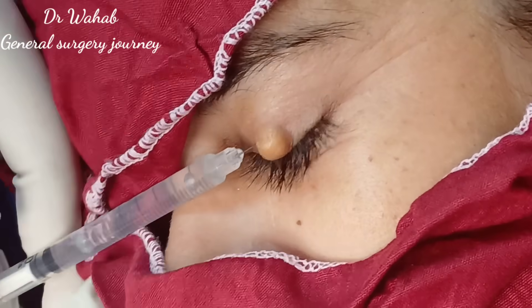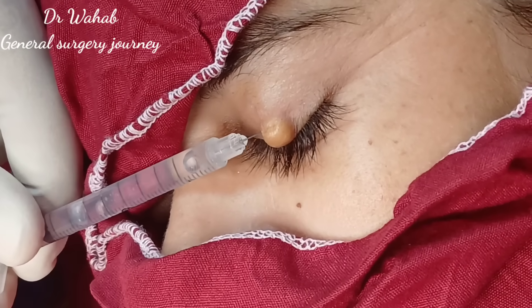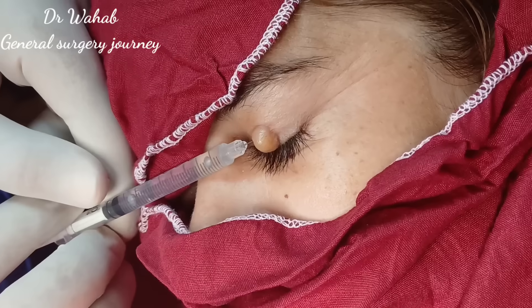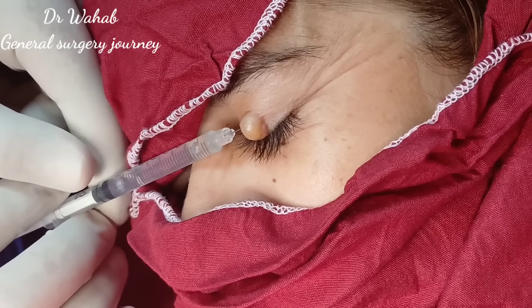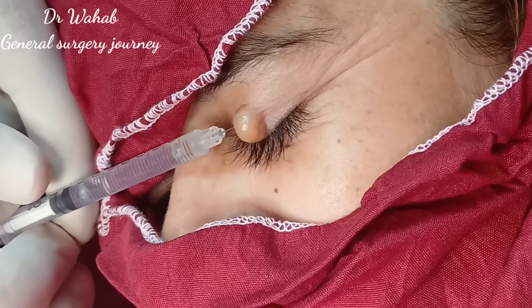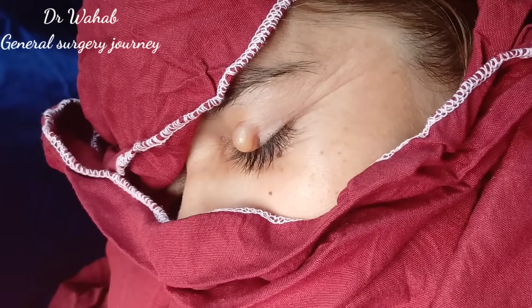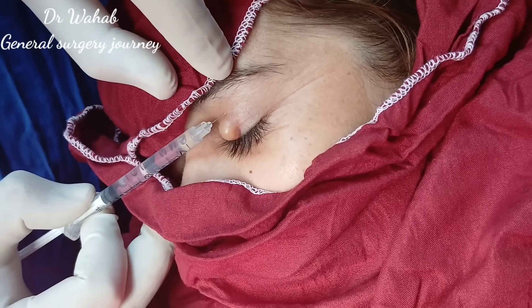Now we are administering local anesthesia using lignocaine injection. There are no associated symptoms such as redness, discharge, or vision changes.